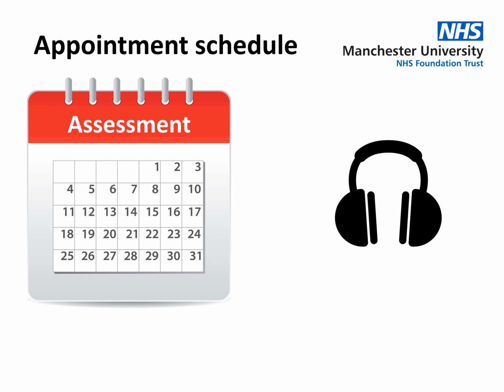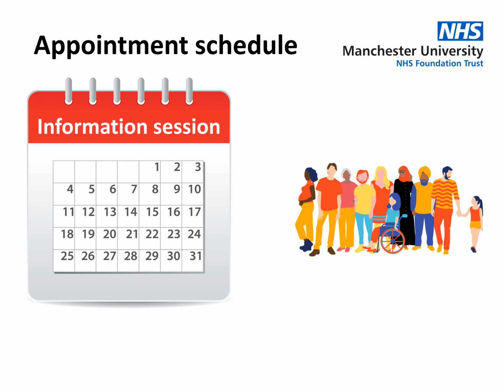Following this initial assessment, your clinician will explain the next steps in the assessment process and what the most appropriate treatment options are in your case. Once we have established that you may benefit from a cochlear implant, it is important that you gain as much information as possible about the cochlear implant so that you can develop realistic expectations about what the benefits and limitations are. There are different implant systems available from the clinic, and further information about these will follow.